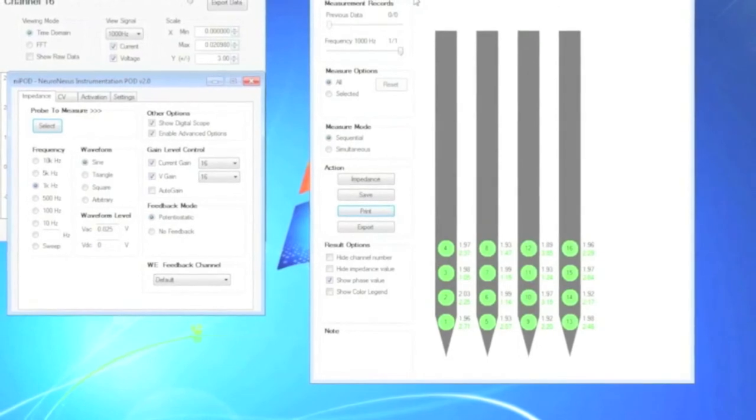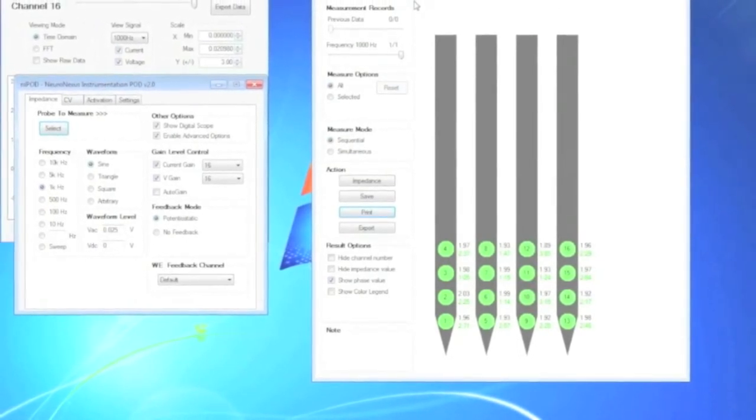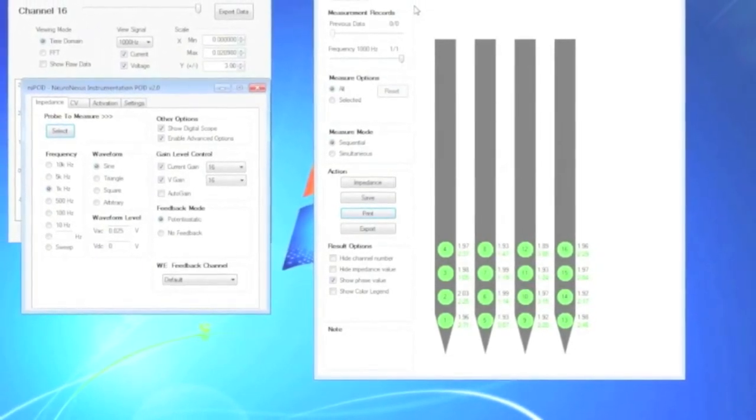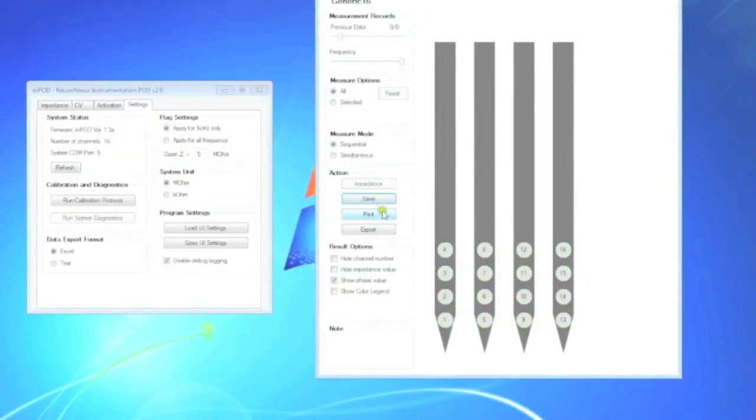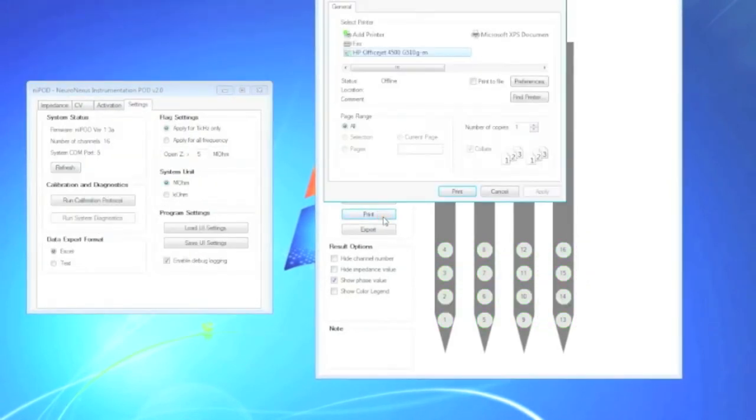Results will be displayed in the probe visualization interface. The color of the sites give a quick visual clue of the impedance level. You can print the data to paper like this.